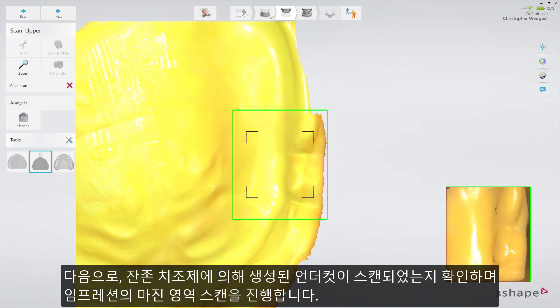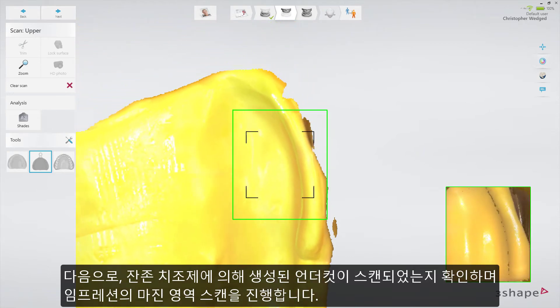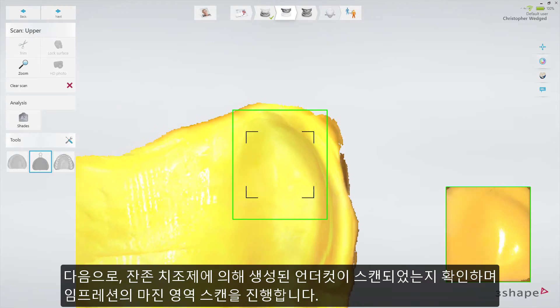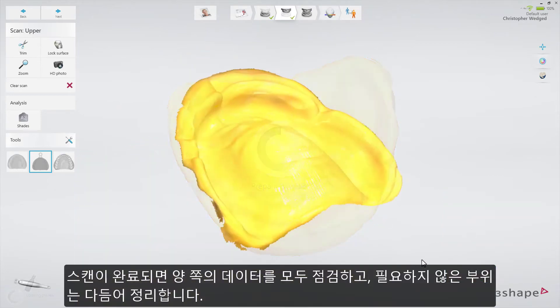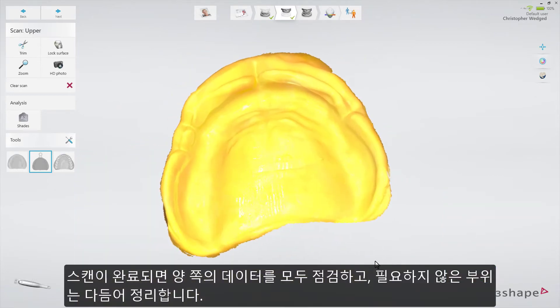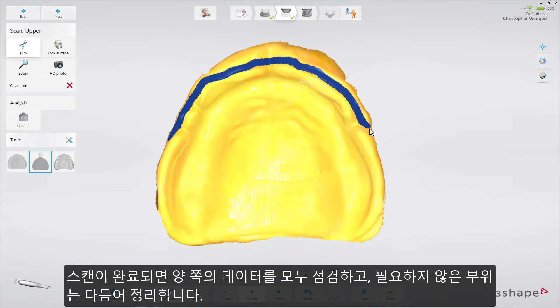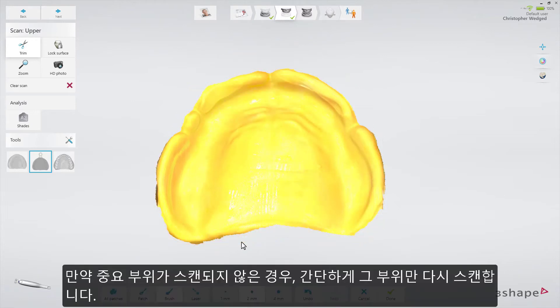Once that is completed, proceed with the marginal areas of the impression, making sure that the undercuts created by the residual ridge are scanned. When scanning is complete, you can inspect the result on both sides and prepare the scan by trimming away any unnecessary parts. If an important area is missing, simply start scanning the area again.